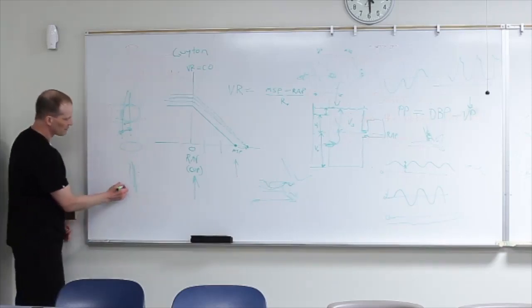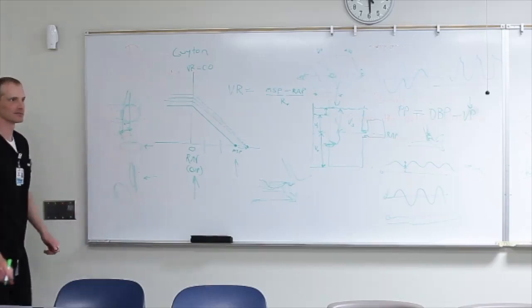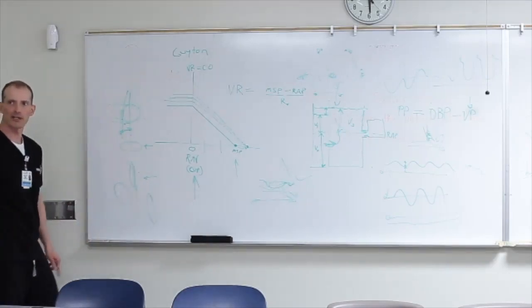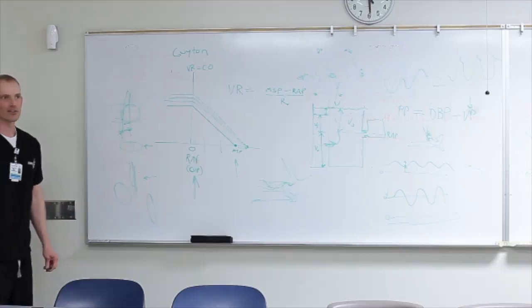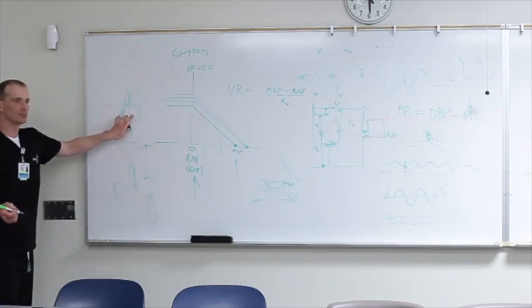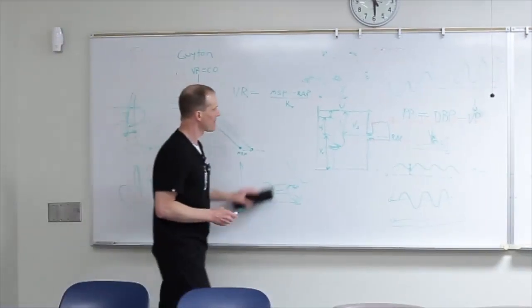If there are high pressures, it should look more round. And if the right atrial pressures are lower, it's going to be more collapsed and more oval. But if I showed you an IVC that looked like this in cross section, you would say the right atrial pressures are low, right? But then if I showed you it in long section, you'd say, ooh, right atrial pressures are high. So the only way to do it is to quickly flip 90 degrees, look, slide it down, see what's going on. And you really should pay attention to centering this and not fan back and forth when you're measuring the IVC. Those are the things to watch out for.